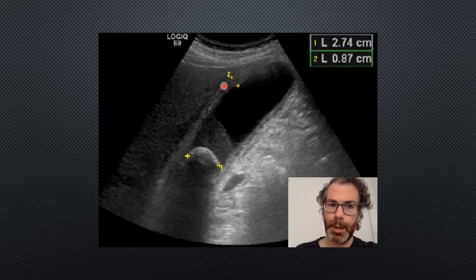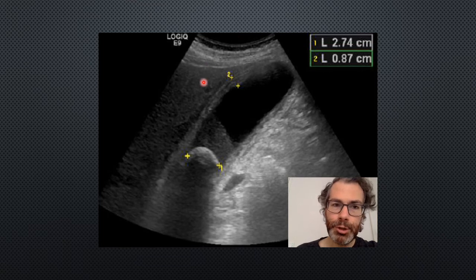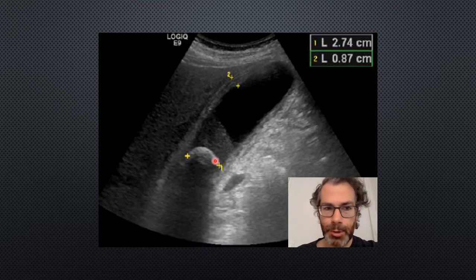And we should always measure anteriorly rather than posteriorly. The reason for this is because of an artifact called post-cystic enhancement. To understand post-cystic enhancement, you need to also understand a little bit of ultrasound physics and the concept of attenuation. When the ultrasound beam comes down from the probe, some of that beam is attenuated, which means it's either reflected away or absorbed, and it gets gradually weaker as it goes down. But different tissues attenuate the beam to different degrees. So, for example, this big stone, all of the ultrasound is reflected away, and so there's a shadow behind.